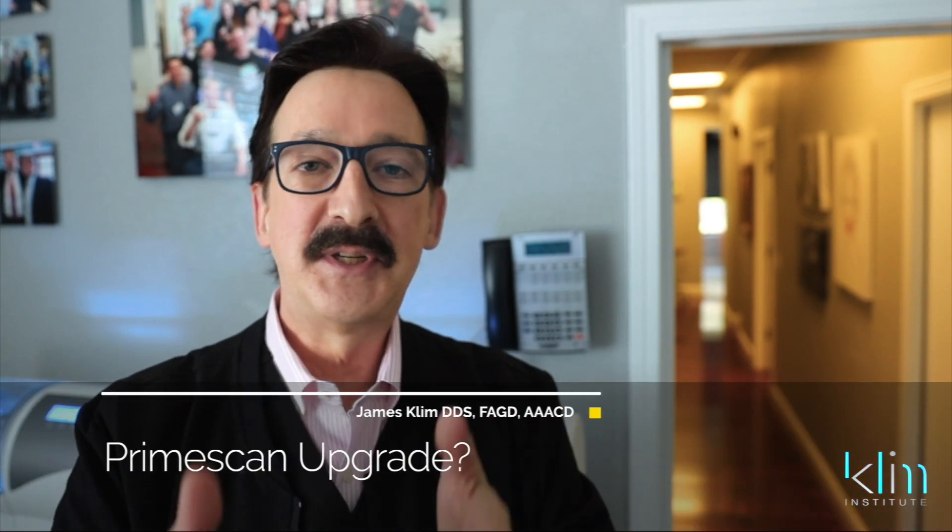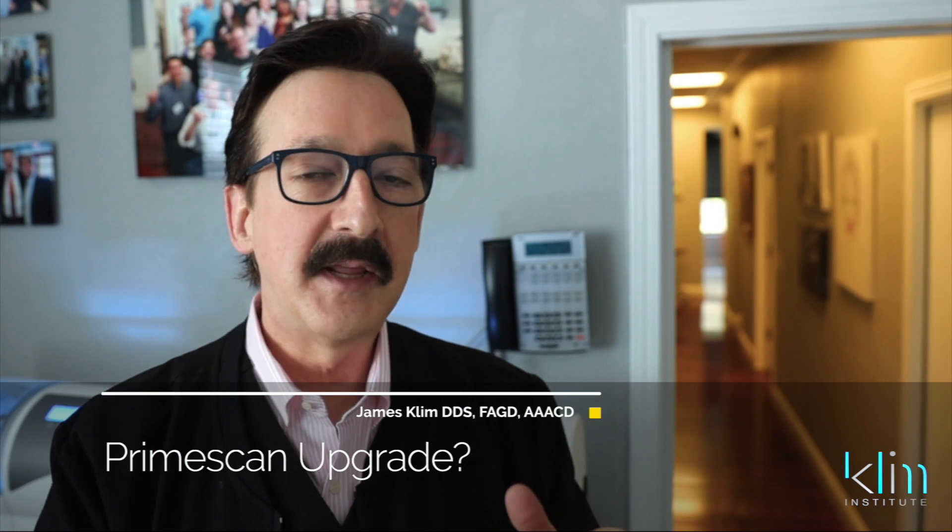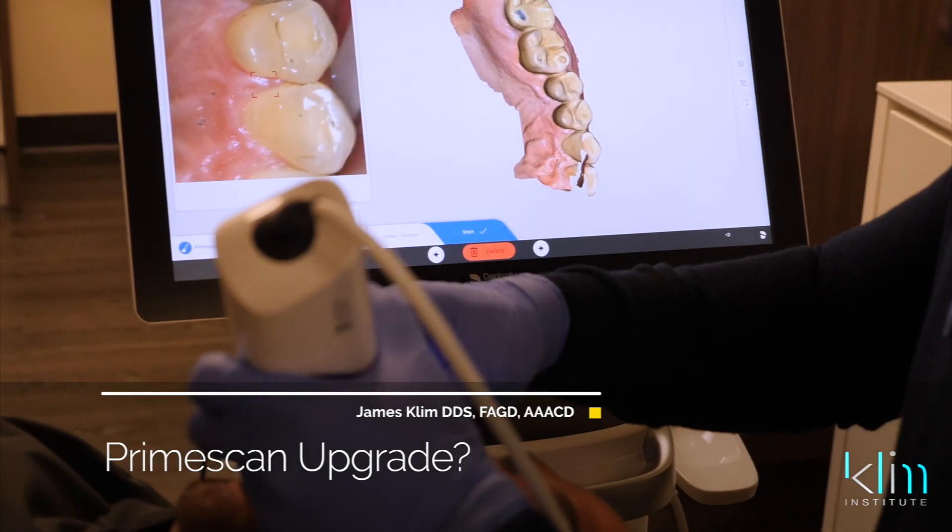Hi, my name is James. I'm already receiving emails and questions about the new PrimeScan and the 5.0 software for CEREC.